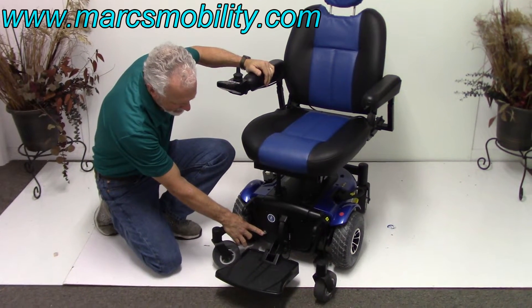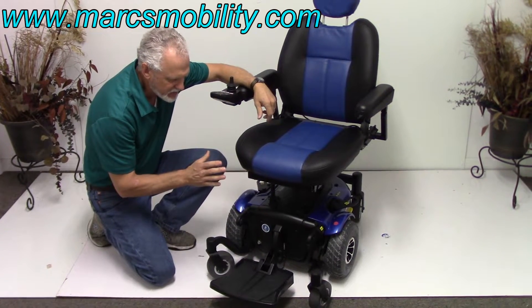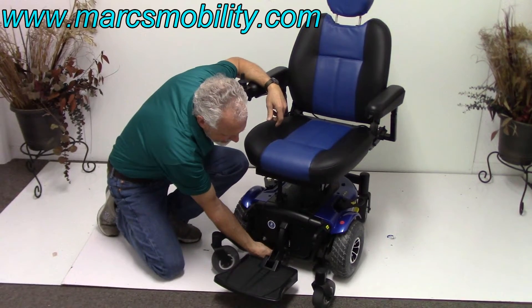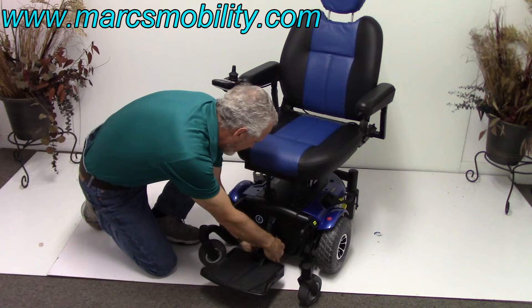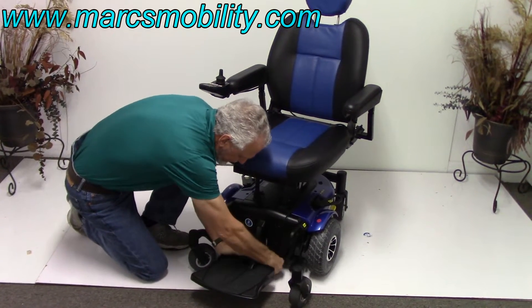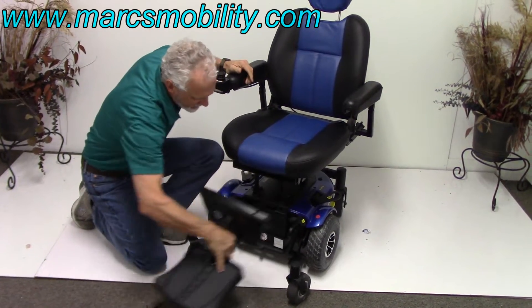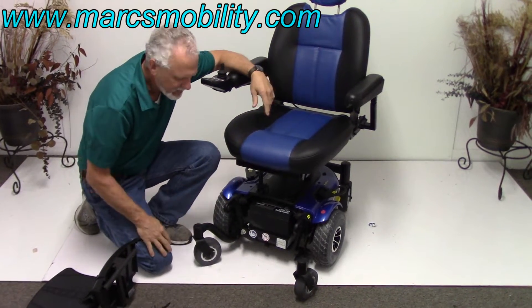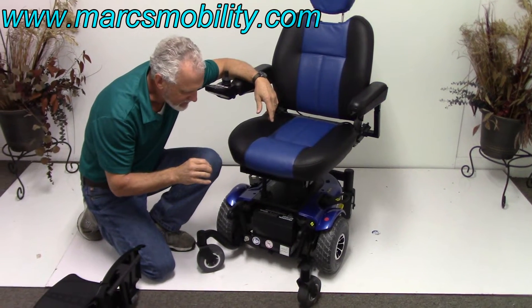You have a reset button here. If you need to replace the batteries in this power chair, they come out from the front. You take this little clip out from underneath — pull the clip out, lift up, and your batteries come out on the tray. There are two U1 batteries in here, 35 amp batteries — it takes two of them.